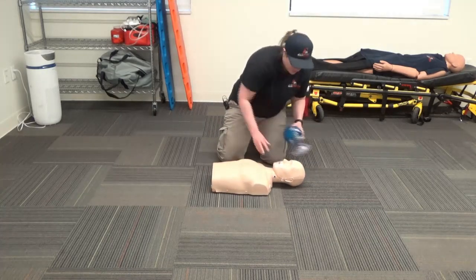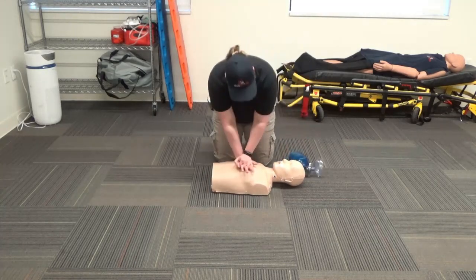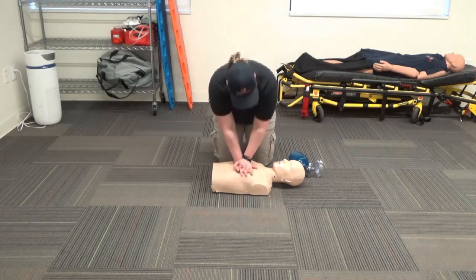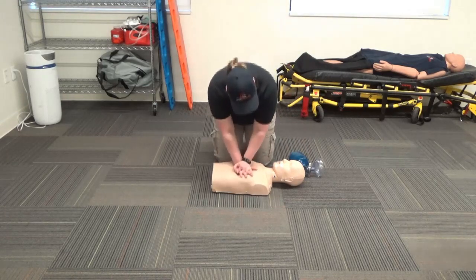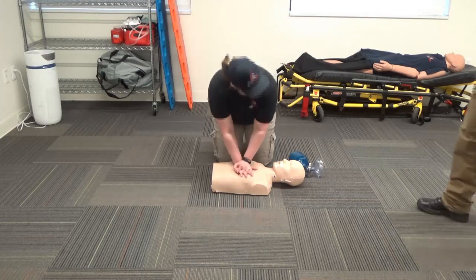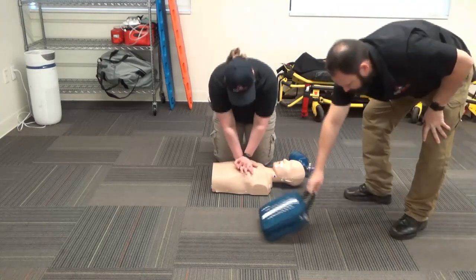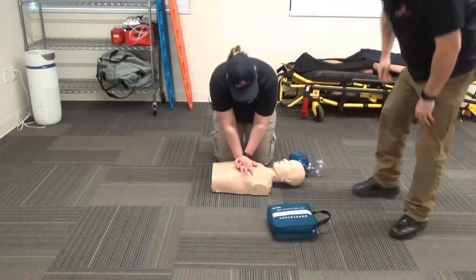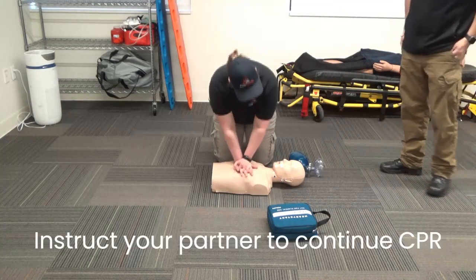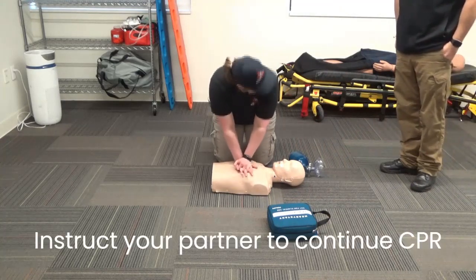One more cycle for 2 minutes of CPR. Continuing compressions: 3, 4, 5, 6, 7, 8, 9, 10, 11, 12, 13, 14, 15, 16, 17, 18, 19, 20. After I finish these compressions, I'm going to have you take over compressions.